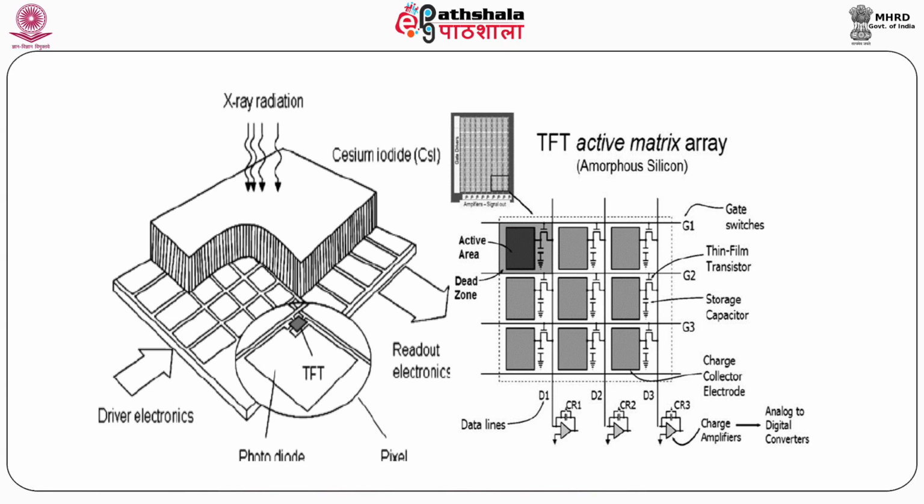Digital detectors have a wide dynamic range. Moreover, the implementation of fully digital PACS with DR is possible, in which images are stored digitally. They can be transmitted within the department or anywhere in the department. Patient dose reduction is possible.